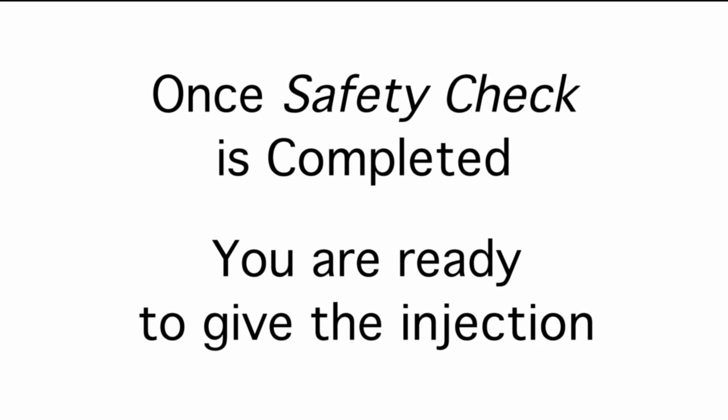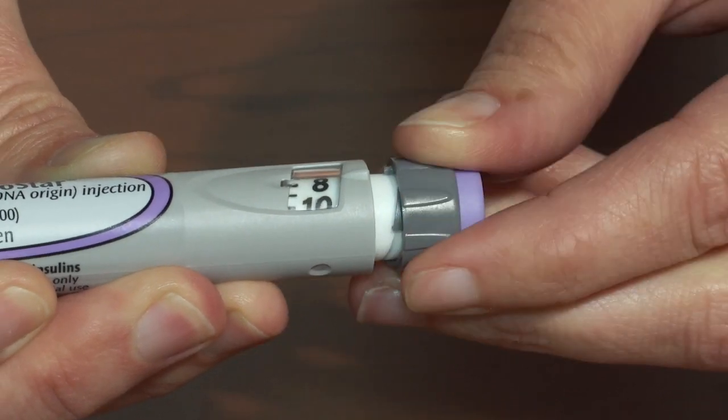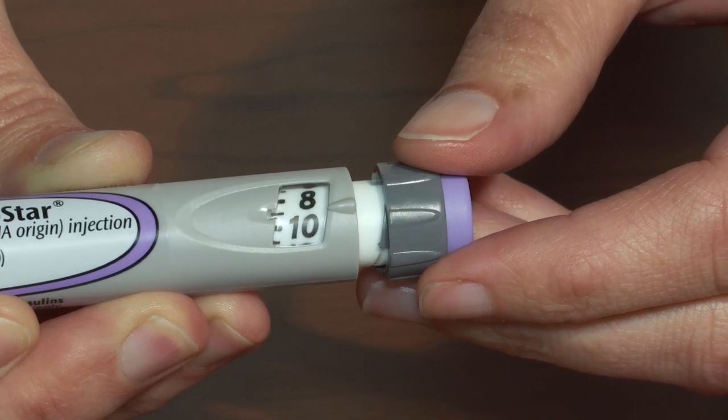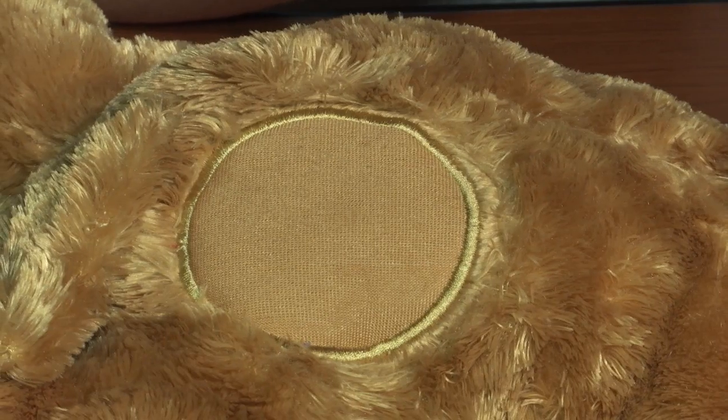Once the safety check has been successfully completed, you are ready to give the injection. Begin by dialing your prescribed dose into the pen. For demonstration we will use nine units for the dose. Your dose will be determined by your diabetes care team.